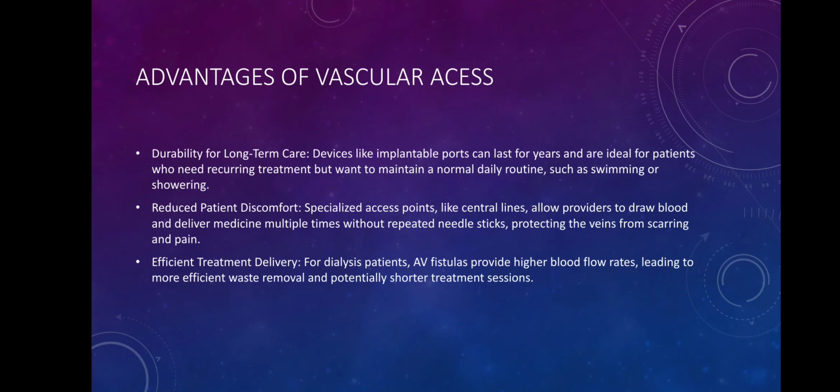Then reduced patient discomfort in a specialized access point: central lines allow providers to draw blood and deliver medicines multiple times without repeated needles, protecting the veins from scarring and pain. And efficient treatment delivery means for dialysis patients an AV fistula provides higher blood flow rates, leading to more efficient waste removal and potentially shorter treatment sessions.